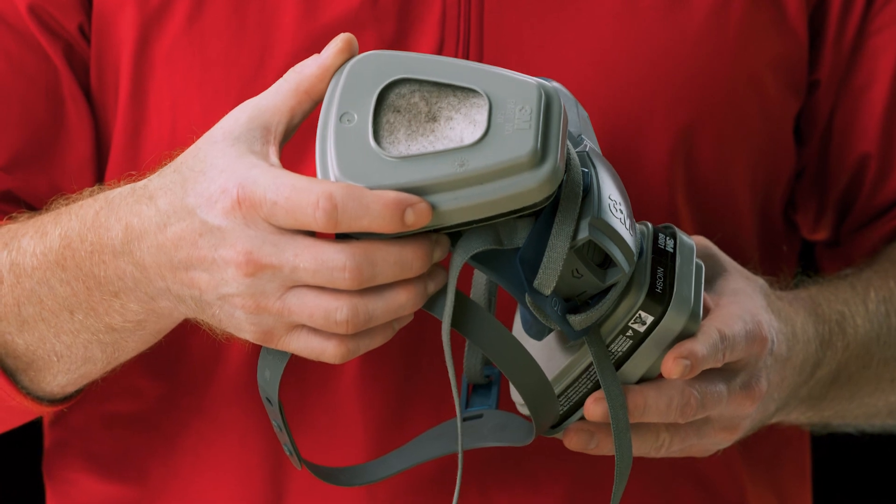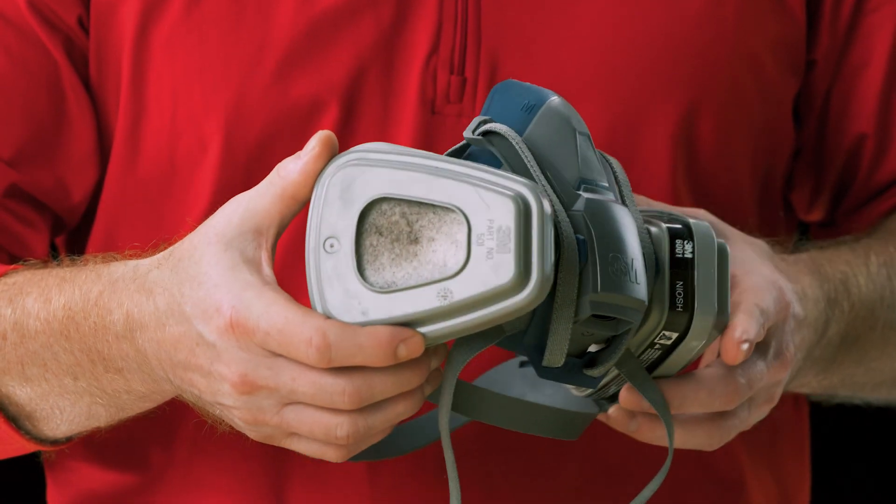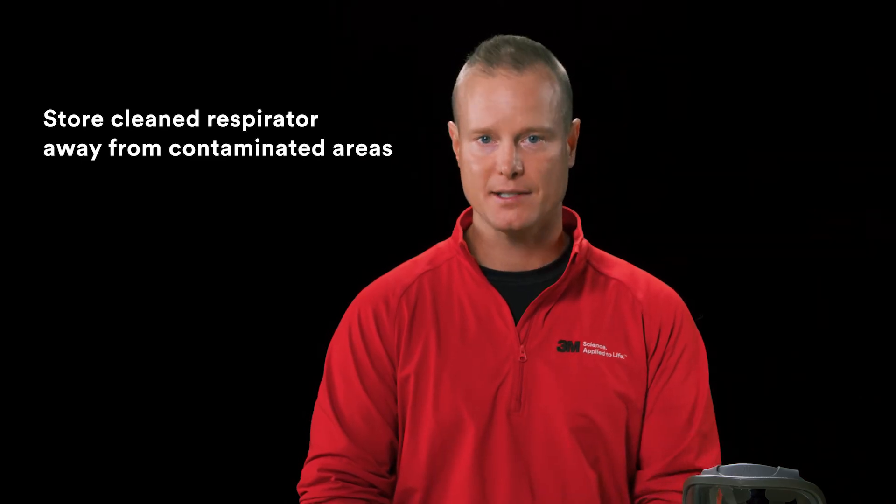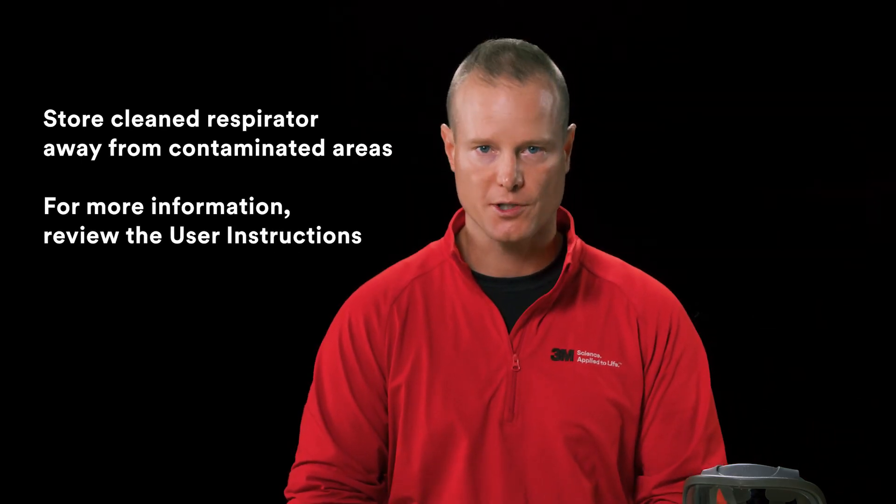Reusable respirators do require regular cleaning and maintenance after each use. Clean respirators should be stored away from contaminated areas. For more information, review the user instructions.